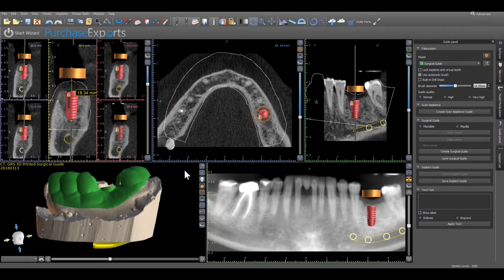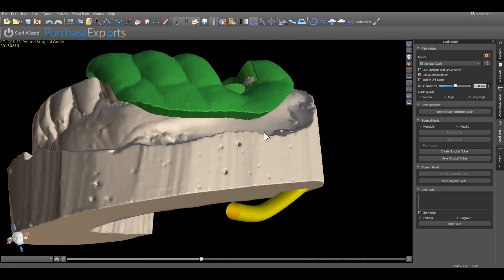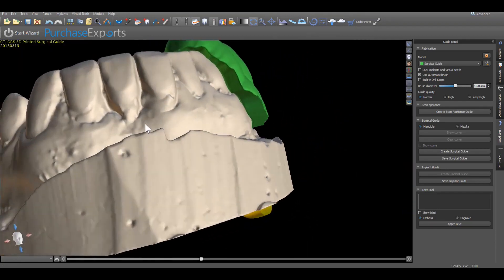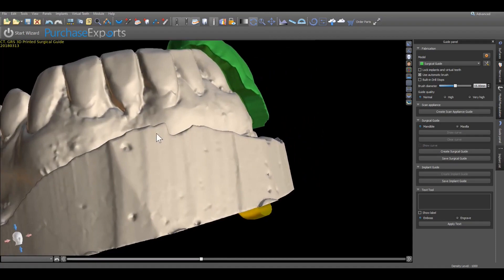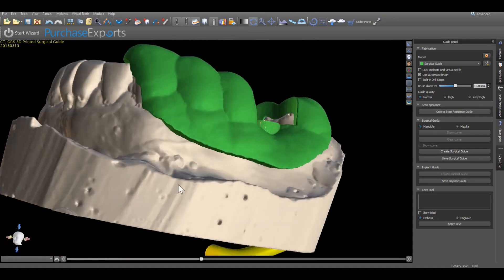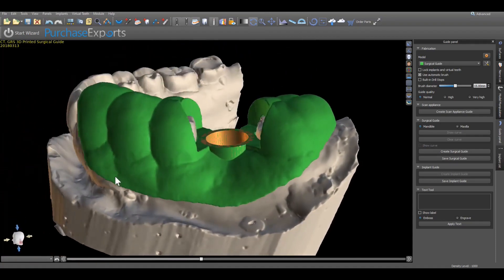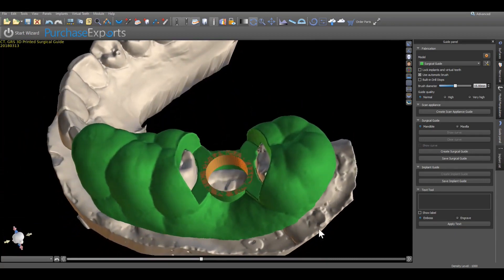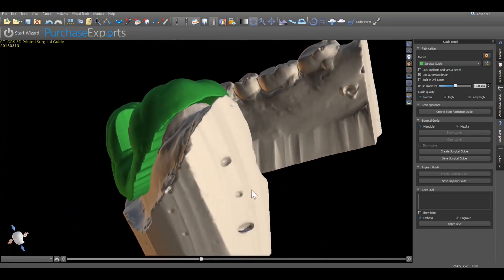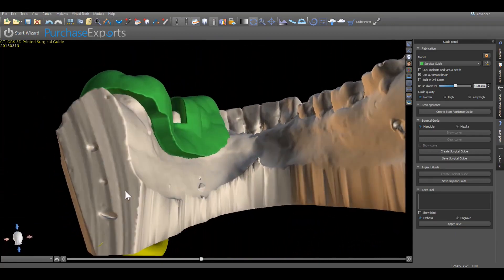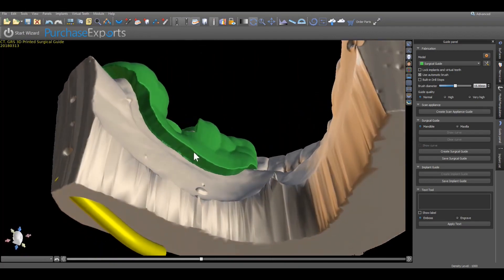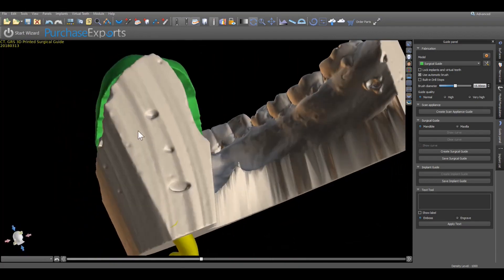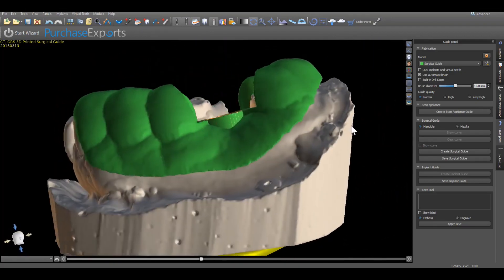Upon completing the surgical guide fabrication, in the 3D modeling window view different perspectives of the surgical guide resting on the model by placing the pointer anywhere on the virtual image and holding down the left mouse button while moving the cursor in the desired direction. By rotating the surgical guide resting on the model, the design of the guide and overall adaptation of the guide to the model can be observed.